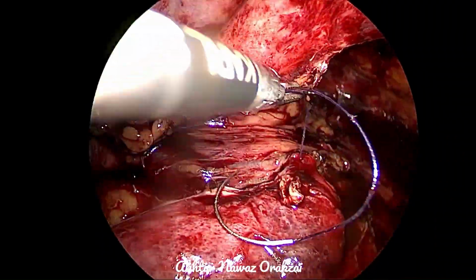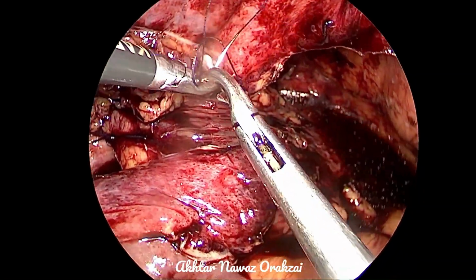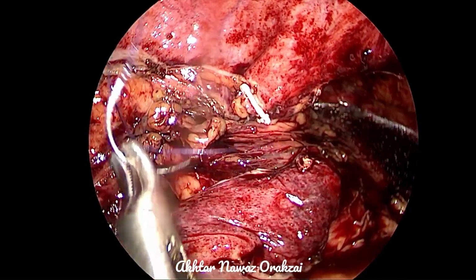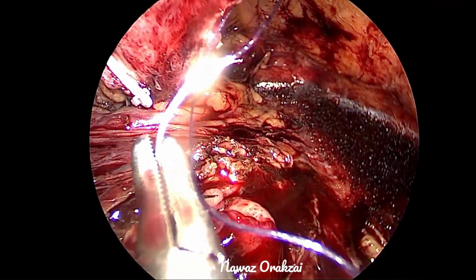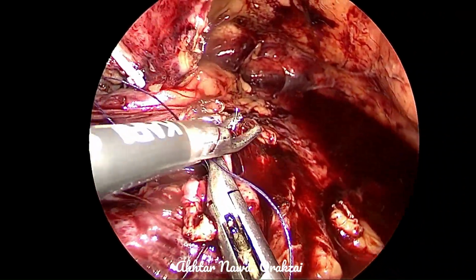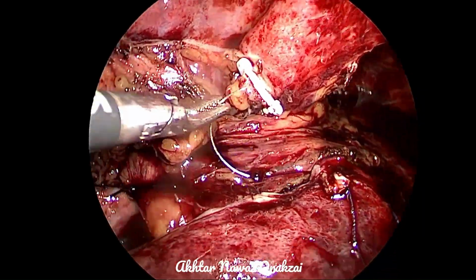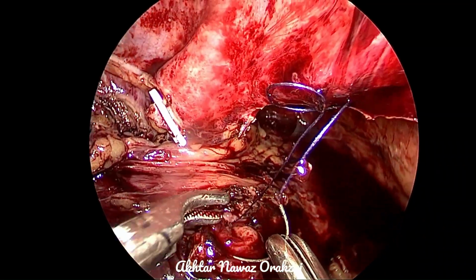And we have to tighten the continuous suture. Now again, outside into the bladder mucosa. At this point, an assistant can do the suction and clean the field so that both the edges of the bladder wall are visible.